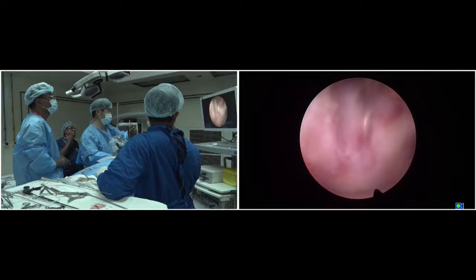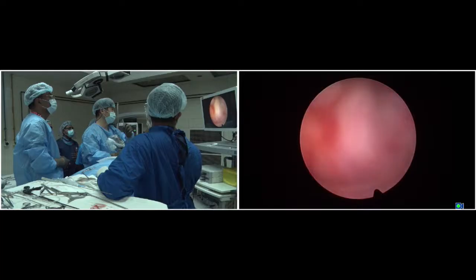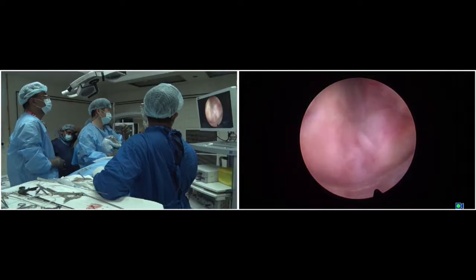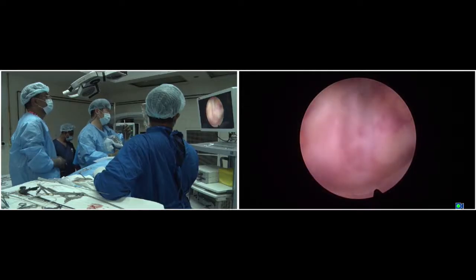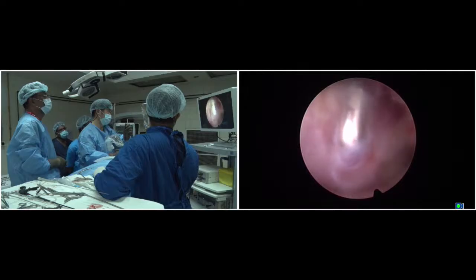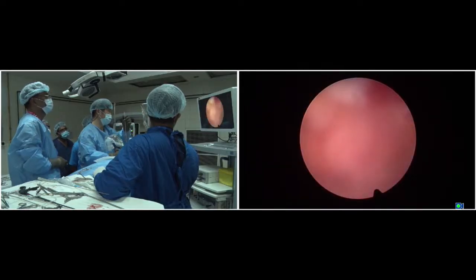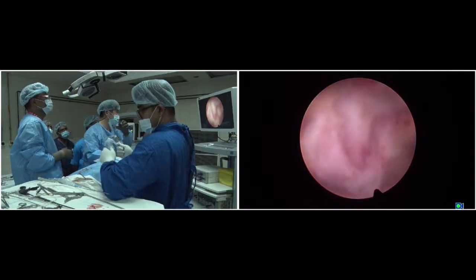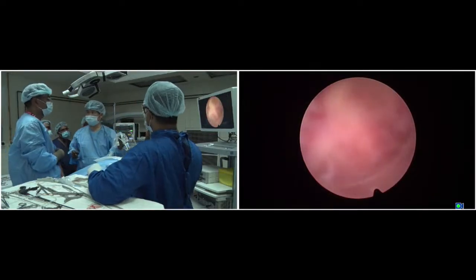I can check to here, but today is not possible. This patient's symptom is already sufficiently solved with the huge disc removal. That is sufficient. Fortunately, this patient's only problem is disc pathology, not stenosis, so the patient's symptom will disappear.